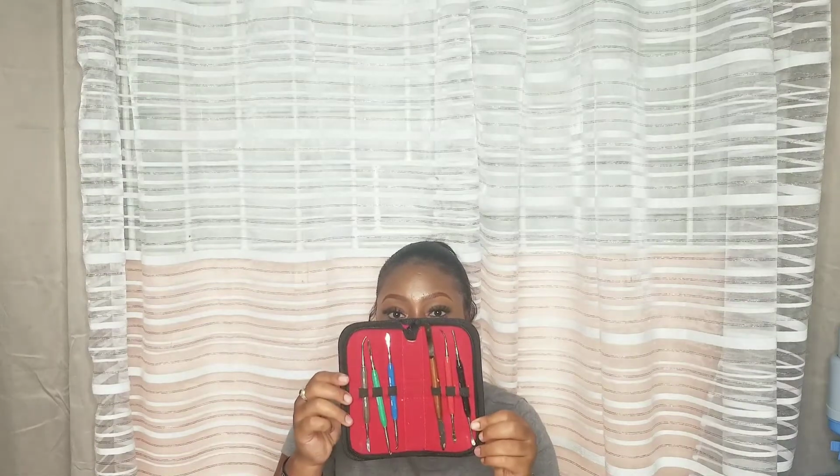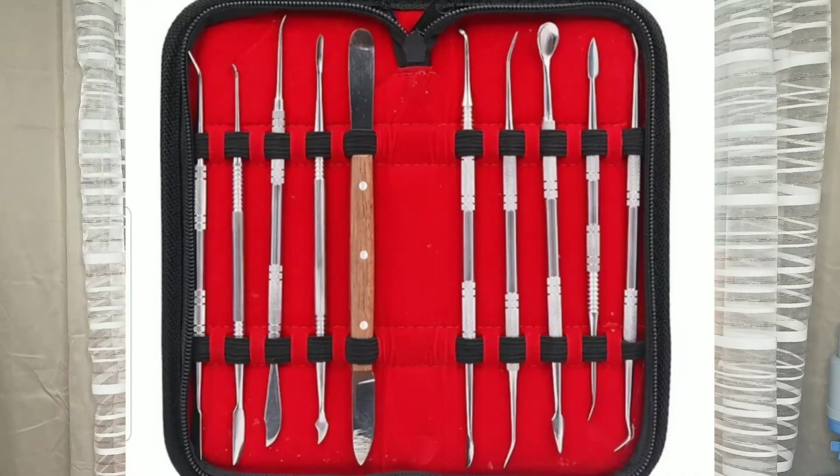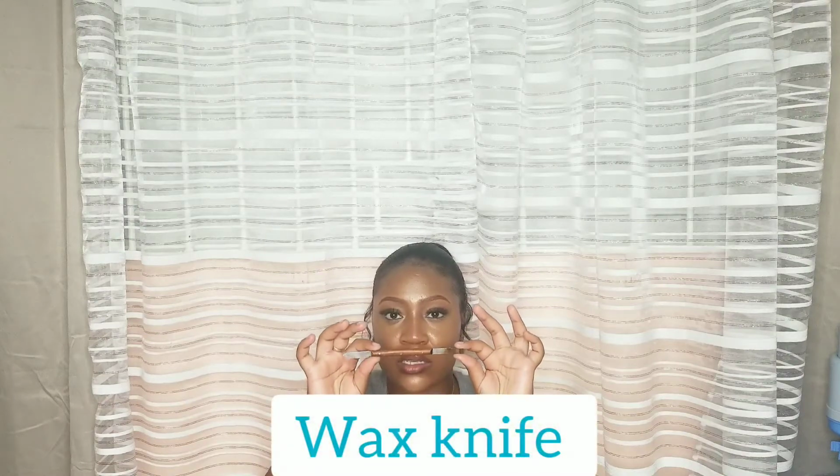This is what it looks like. There are different variations in terms of the carving kit. Most of my classmates had the one that had about 10 different instruments inside of it, which is good because you have more instruments to work with, and then you choose which one you're comfortable with. So you're definitely going to need a carving kit. Some of those carving kits, they come with a buffalo. Is this a buffalo knife? I think that's what it's called.